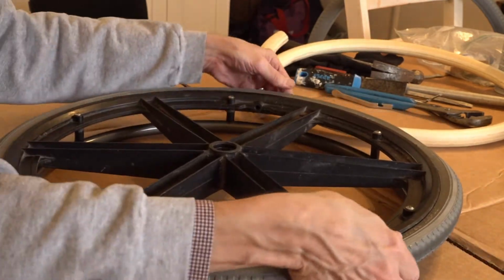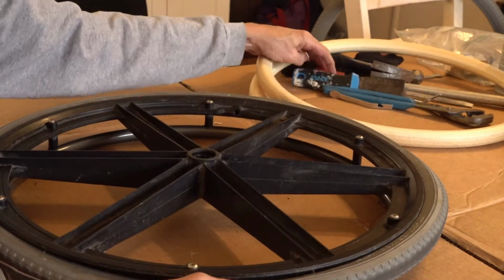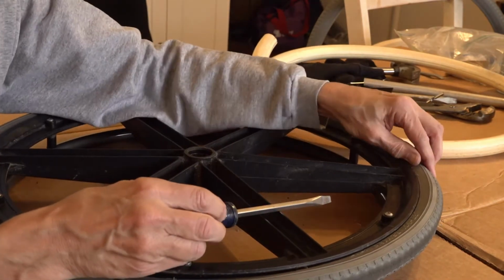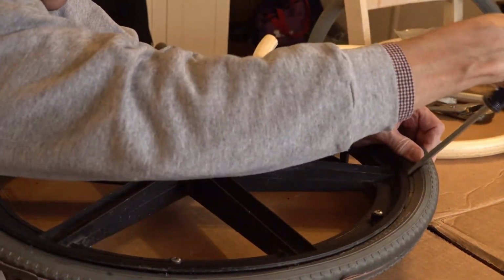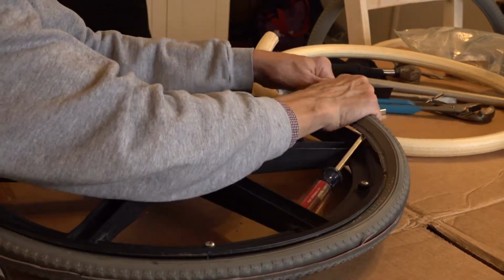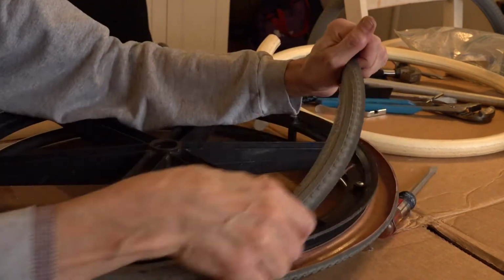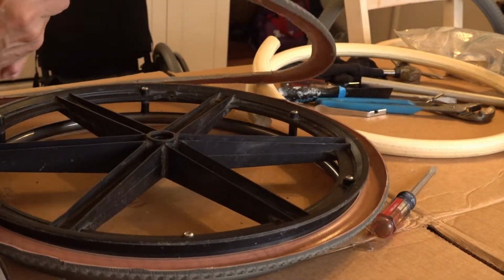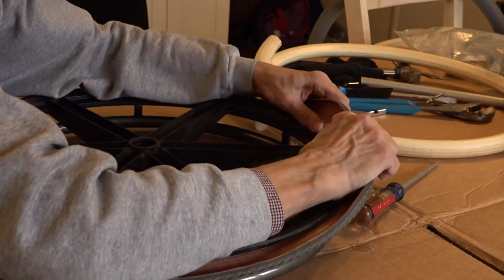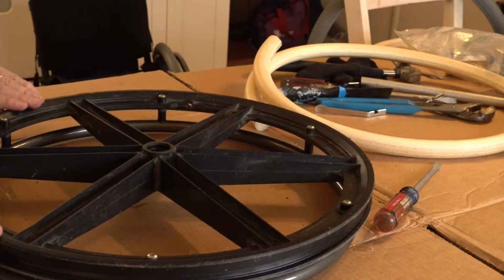And loosen up the pieces of the tire here, and with the help of the screwdriver, starting to loosen and get the old piece from here. And so the old one is off.